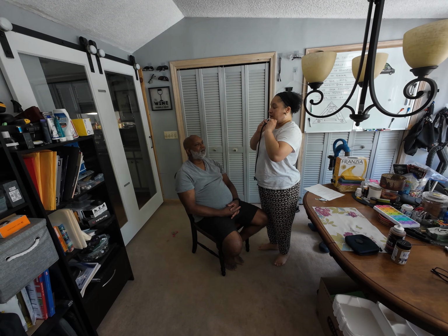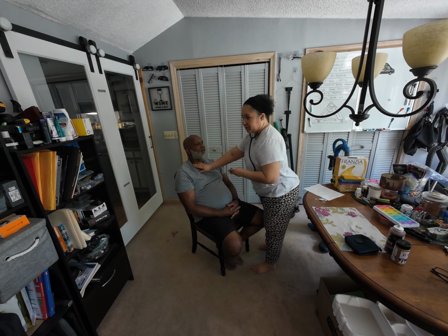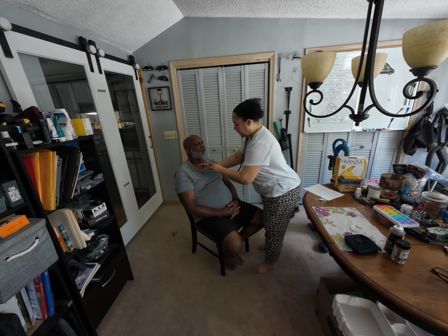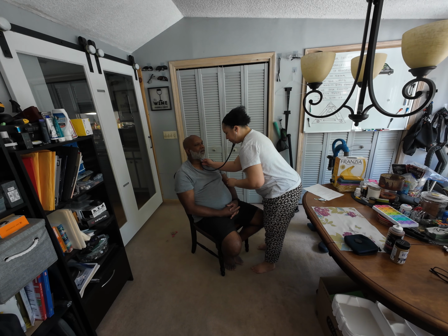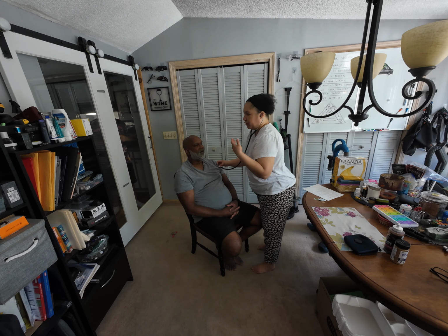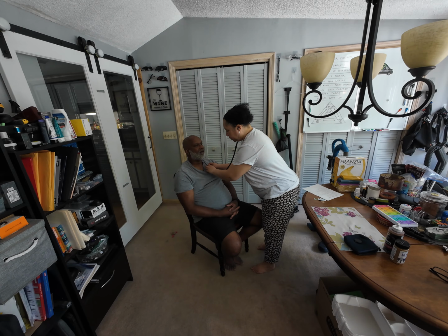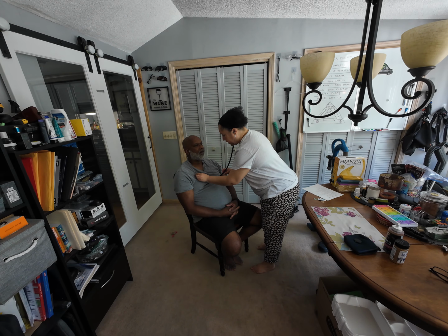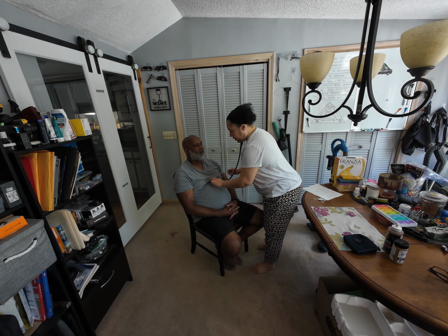So first, I would start at the, above the clavicle, sorry, and I would have him take a deep breath in and out, and then the opposite side. And then I would work my way down. And for the purpose of this video, I won't have him do the breath sounds, but I would do a ladder approach on each side, like so, and all the way down.